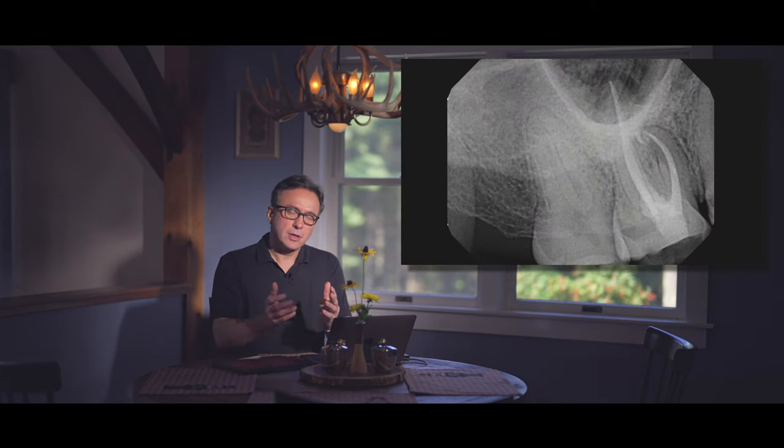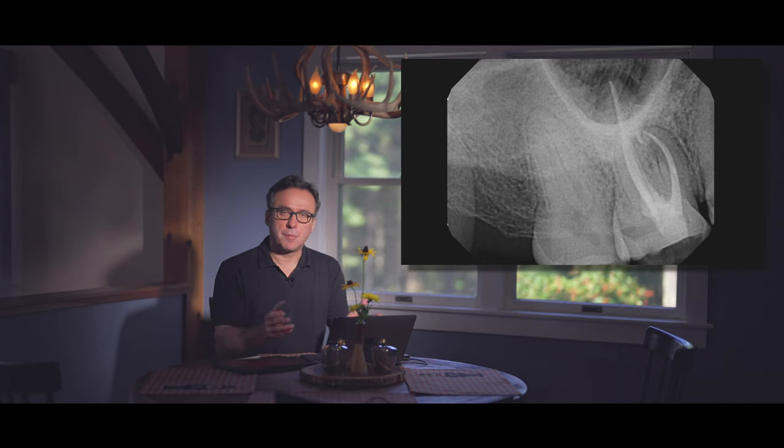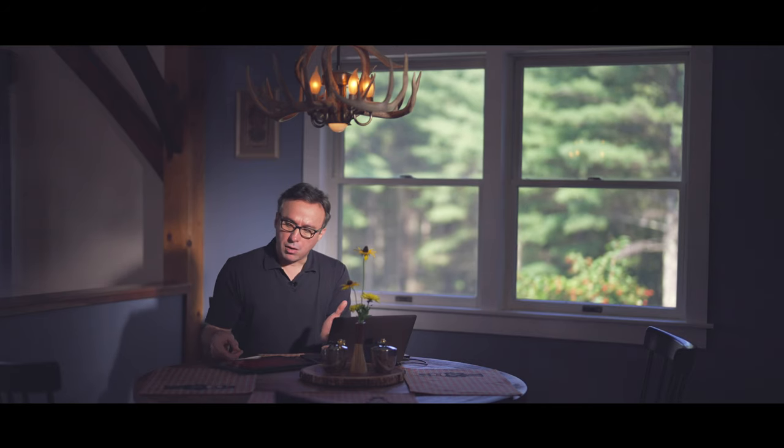This surgical case is unique in the sense that it involves doing a palatal surgery, which is not so common endodontically. Most endodontic failures in maxillary molars occur in the buccal roots — primarily because of the ribbon-shaped anatomy of the mesiobuccal root, and sometimes the distobuccal root. Failures on the palatal root are uncommon because it's a larger, straighter, fairly round root that matches the shape of our files.